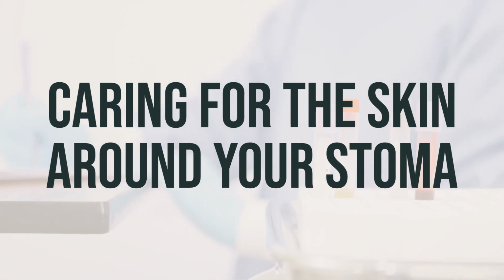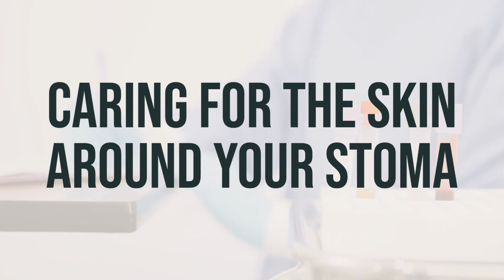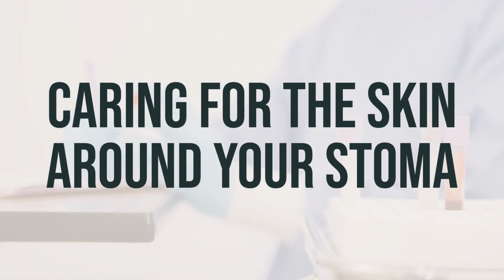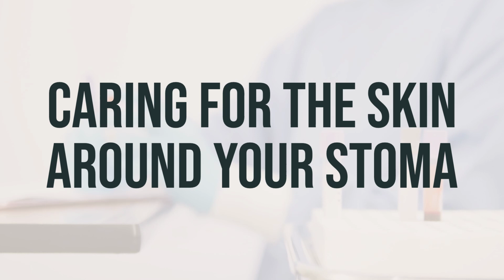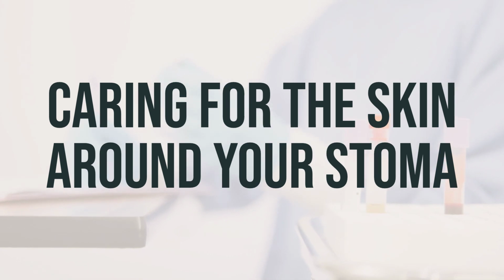Keeping the skin around your stoma clean is important. Use water and mild soap to wash the area, and avoid using alcohol, oils, or fragrances. Alcohol can dry out the skin, perfumes can trigger allergies, and oil-based soap can make the skin slippery, which can make it difficult for your pouch to attach properly. If you have hair around your stoma, consider carefully shaving or using other hair removal methods to ensure that the hair doesn't interfere with the attachment of your ostomy system. However, always check with your ostomy nurse for specific instructions.